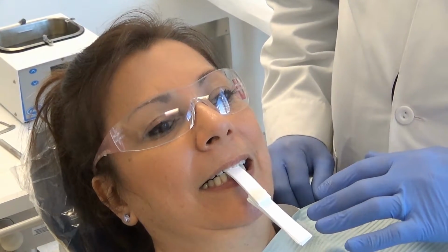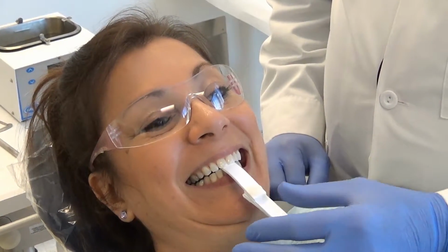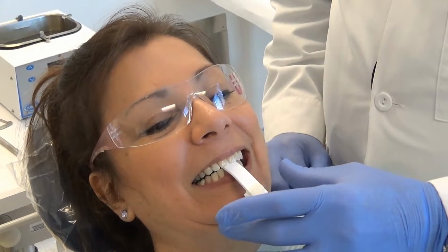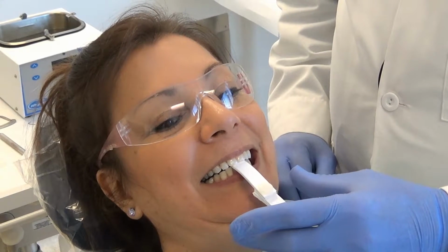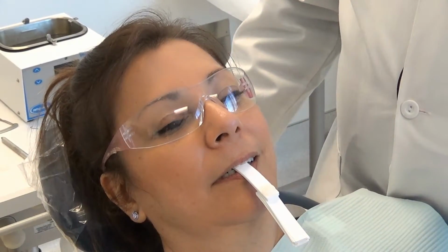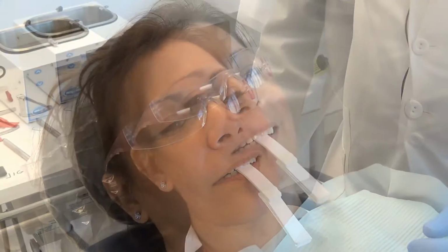Okay, so if they're not touching any of their back teeth and they're biting on this leaf gauge and they put a little bit of pressure, but not a lot, their mandible is going to slide back into centric relation. And you want to let them sit like this in a relaxed position for 5 minutes or so. That'll deprogram their muscles so that you can get them into centric relation, have them float right back into that retruded position.